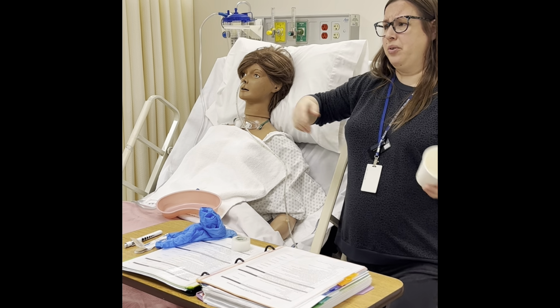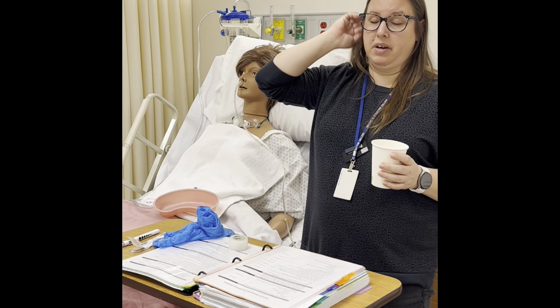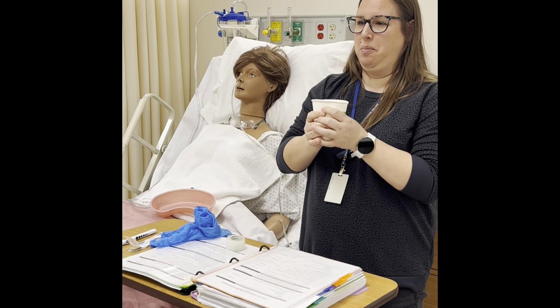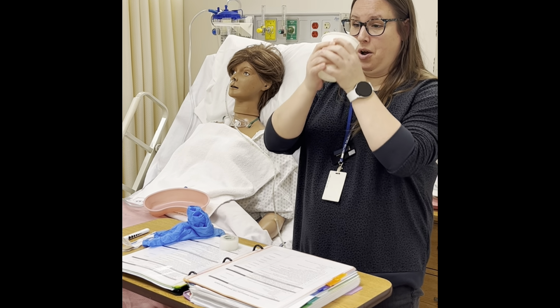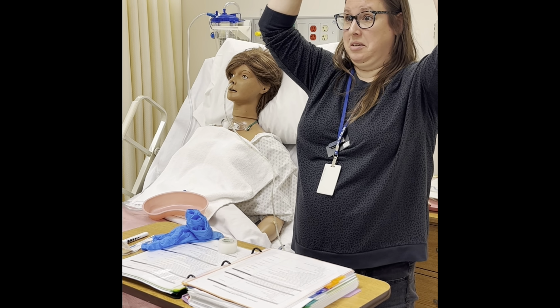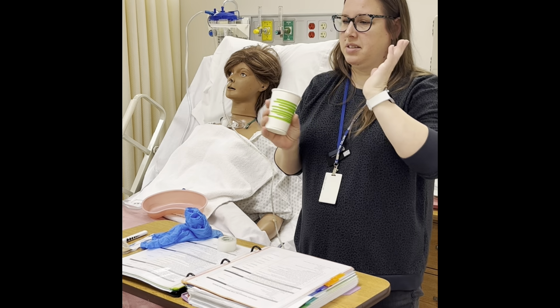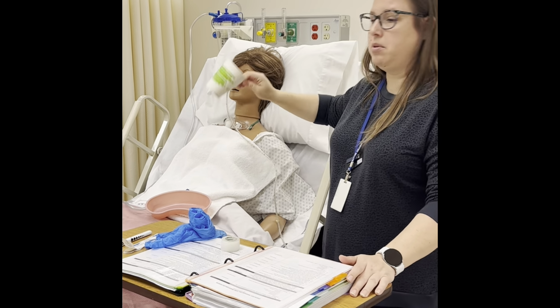The other thing is people focus, and I've watched people, I say fine, whatever, give them a glass of water. They go like this, and then they start to shake. And then what happens? They start to crush the cup, and because they're styrofoam, either the water falls down, or I've had it pop up in there like a fountain. Because nobody gives anybody that much water to swallow. They give them the full 360, like the whole cup is water. It's just a gigantic mess. I always just say, don't use it, but at this time you could say, I could give my patient a glass of water.